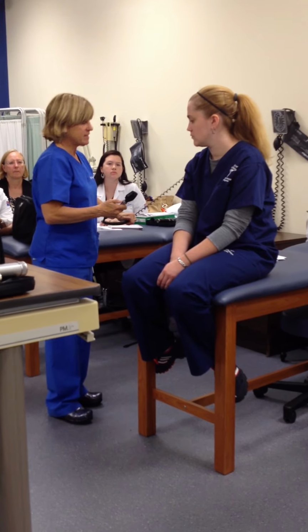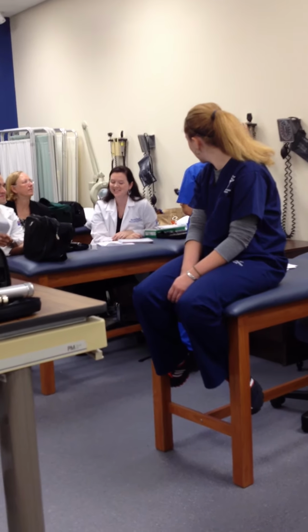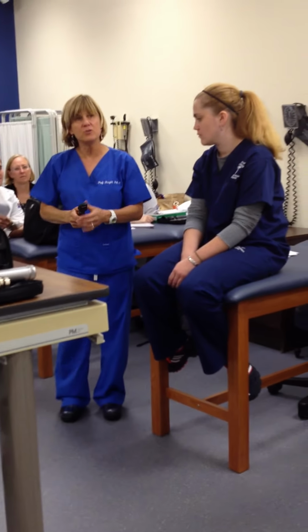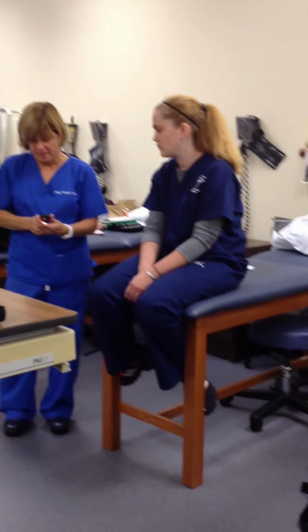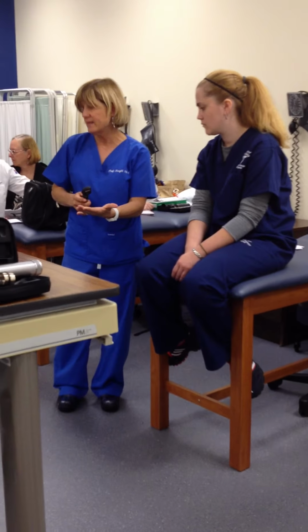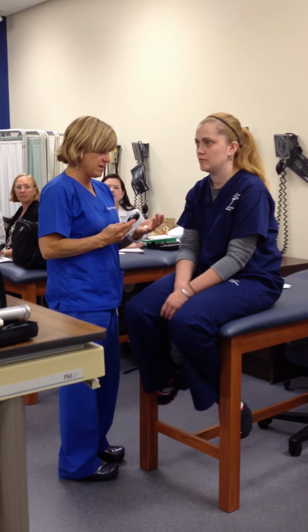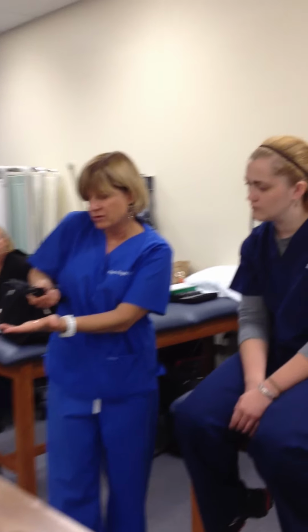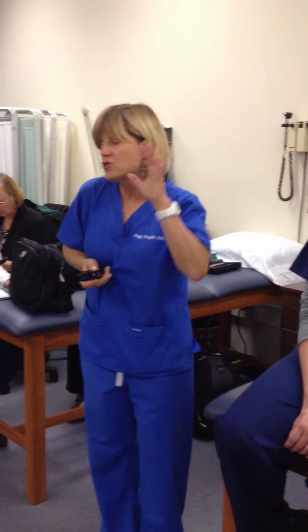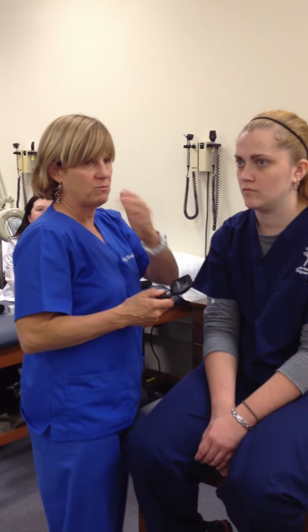All right, fundoscopic exam. If you're using your regular, traditional one, you're going to dim the lights, and you do need to dim the lights. You're going to put the diopter on 0, and turn your light on. The patient's going to look across over there, and you're going to come in at about a 45-degree angle. You're also trying to make your little circle the smallest diameter you can. That keeps her from constricting too much. And then you look right across. Again, lights would be dim. If you're in a private room, just open the door a notch.